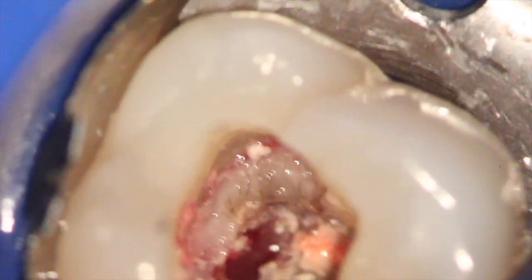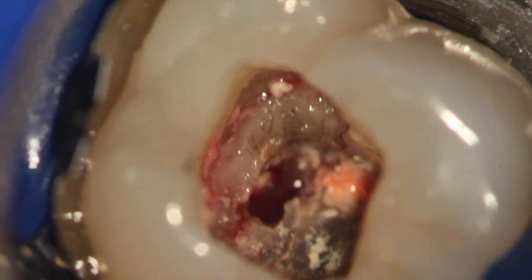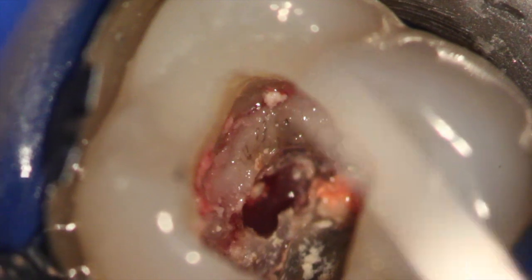The bottom line is we really don't know what we're going to see until we go in there. The structures are all compromised. As we take a closer look, I diluted the hypochlorite to one-tenth of the normal concentration. Rinsing through the microscope, you can see something looks a little bit suspicious on that distal, and a closer look reveals the resorption — the resorptive dentin — or possibly some bone ingrowth or compromised tissue.